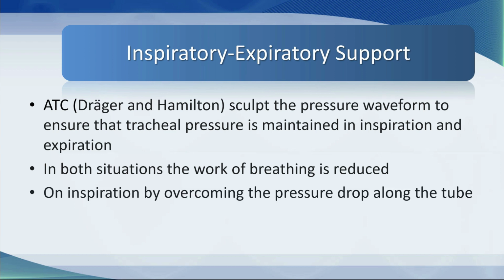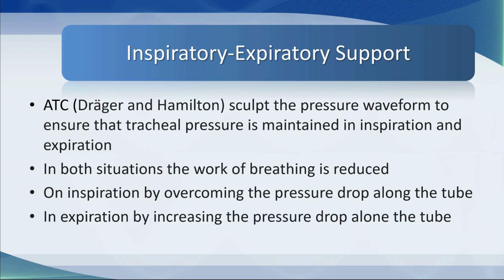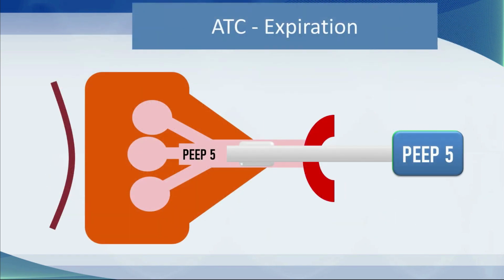On inspiration by overcoming the pressure drop along the tube, and in expiration by increasing the pressure drop along the tube. And it is used alongside all of the different modes of pressure limited ventilation that are on these two ventilators. Now I want to explain what I mean by expiratory support.